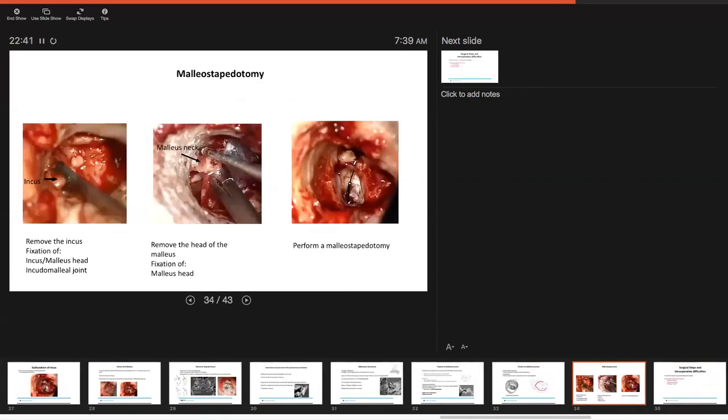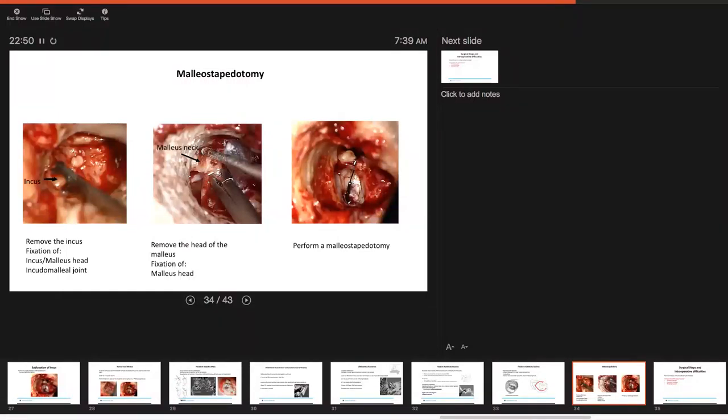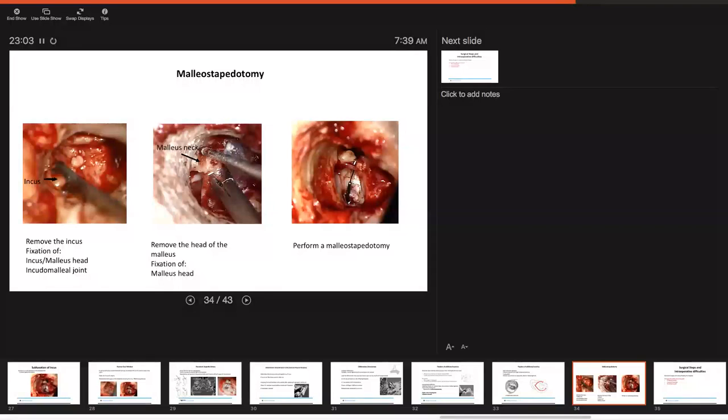A note on malleus stapedotomy. For malleus stapedotomy you want to remove the incus. You may see fixation of the incus or malleus head or the incudomalleus joint. The middle image just demonstrates the removal of the head of the malleus. This demonstrates the fixation of the malleus head and lastly this is really an end image of a malleus stapedotomy having been performed.